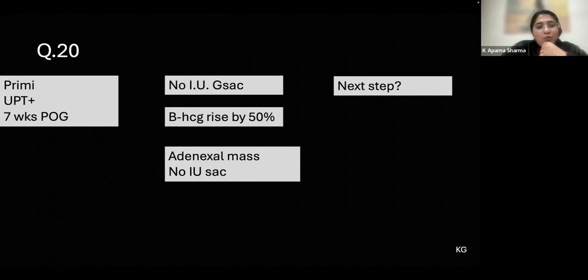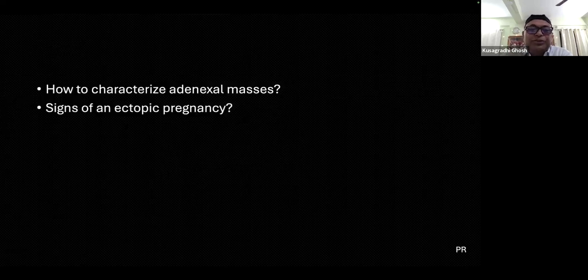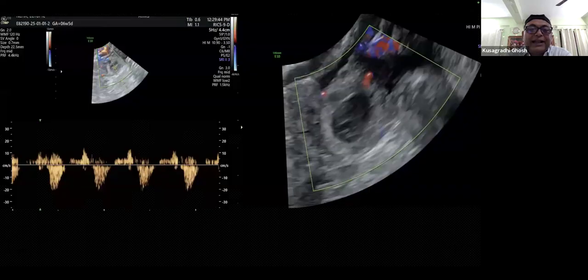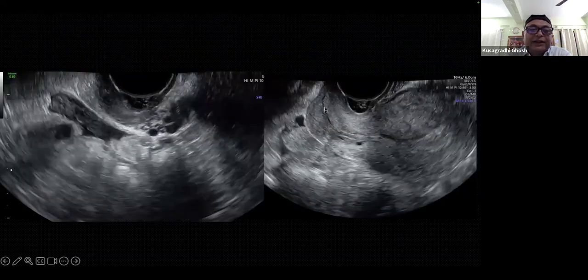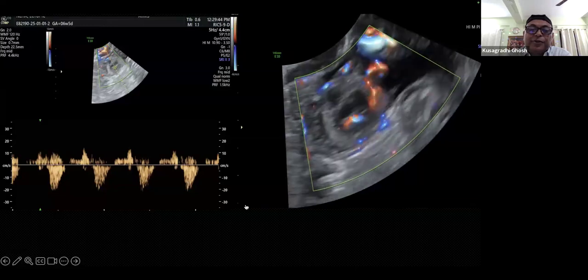Well, this is basically an extrauterine pregnancy, because you see, it showed the uterus and it's empty, both the uterine cavity, endometrial cavity, and the cervical cavity, endocervical cavity, and there is free fluid. In all probability, this would be blood. And when you say pregnant, I suppose the pregnancy test is positive, or some beta HCG was done and it was higher than 50 or so.